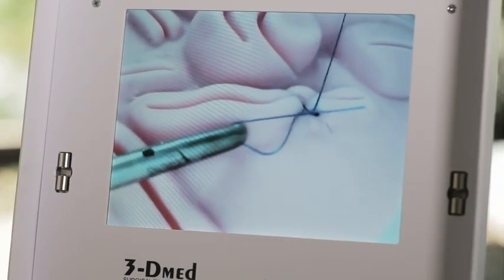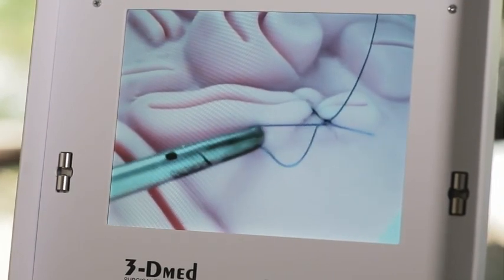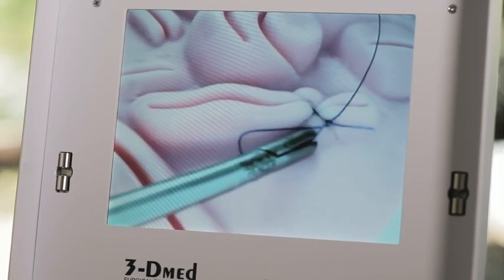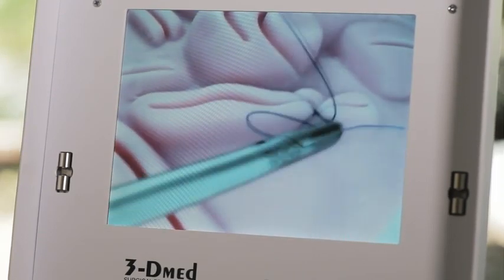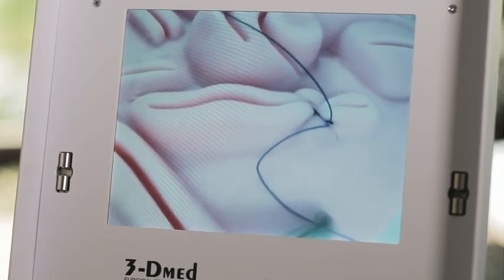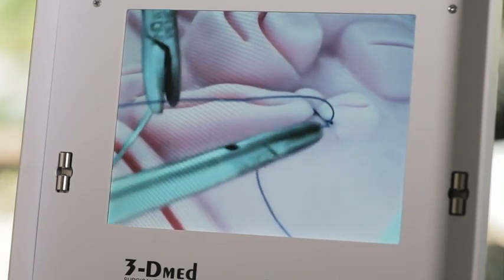Now here I've demonstrated something that I wish I wouldn't do. When you have a long tail, if you grab it less than half of the length, it's going to loop like this. So you must, when you grab a long tail, grab it more than 50%, the distal half of your tail, so that when you pull it through it doesn't loop.